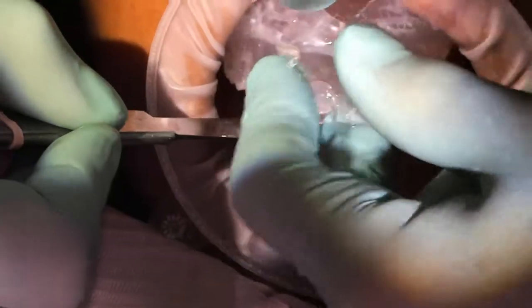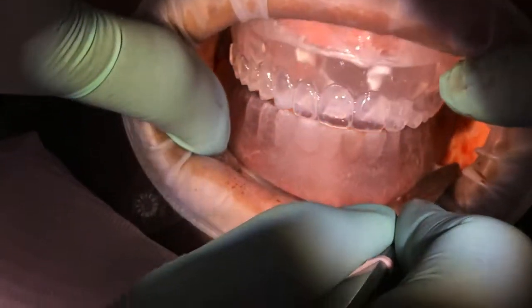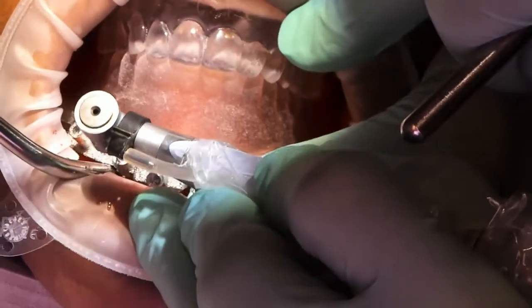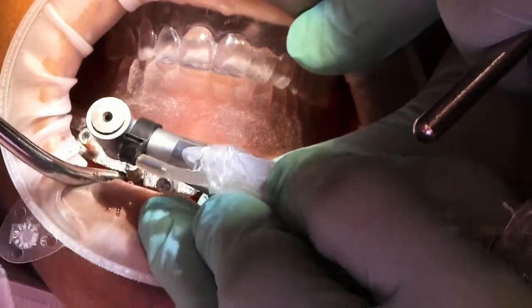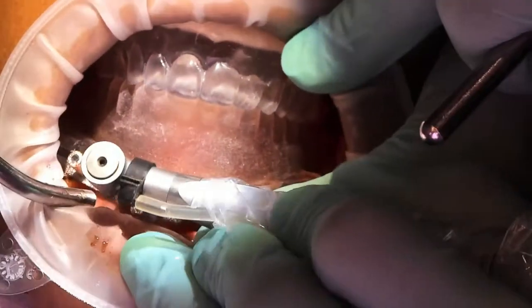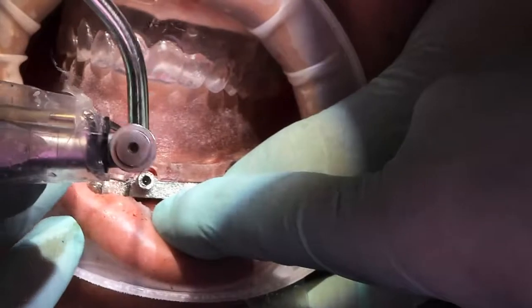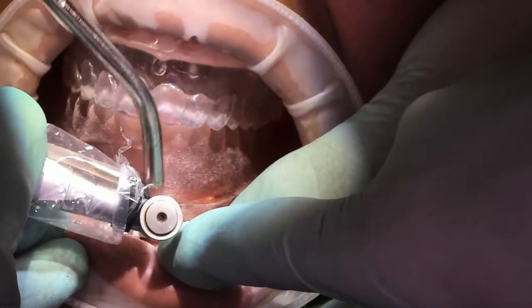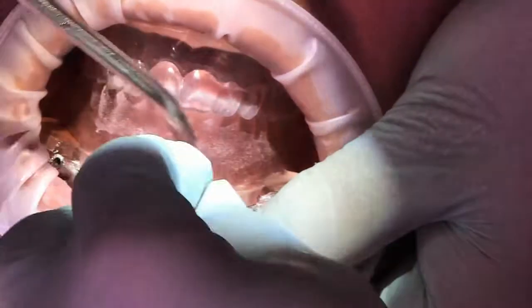As mentioned earlier, the double arch chrome edentulous surgery is unique. The pin guides — both maxillary and mandibular — are seated at the same time. They are adjusted to make sure that there is no rock; they must have a stable, steady seat on the upper and lower, and the bite must come together. Adjust a little bit as needed. Both pin guides are seated and adjusted until there's no rock and the occlusion comes together perfectly. Then they are removed from the mouth and assembled with the fixation bases. With both assemblies, they are reinserted into the mouth and the patient's mandible and head are held together while the sites are drilled.